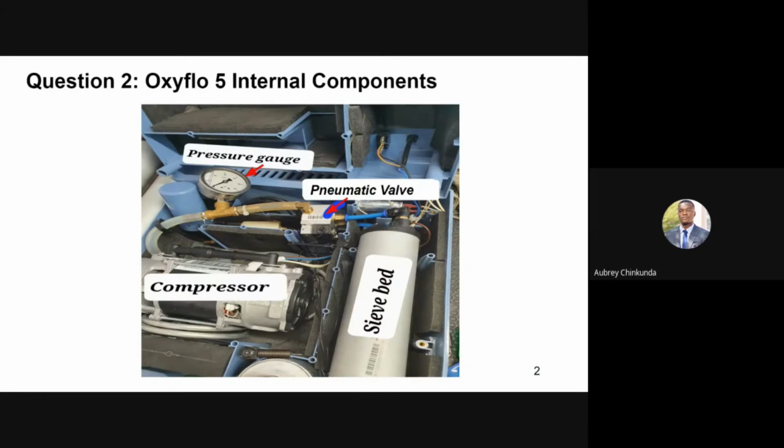And the various causes for this alarm can be a faulty cooling fan, no proper ventilation to the machine, and a faulty temperature sensor. The H04 alarm indicates low purity. When oxygen purity goes below 82%, the machine sets off the alarm.